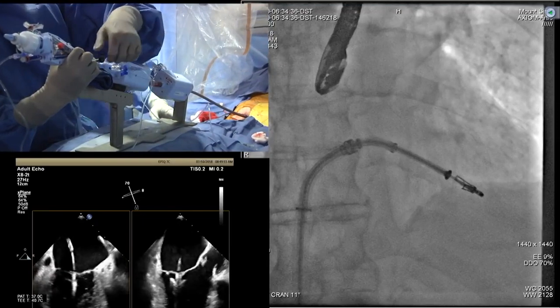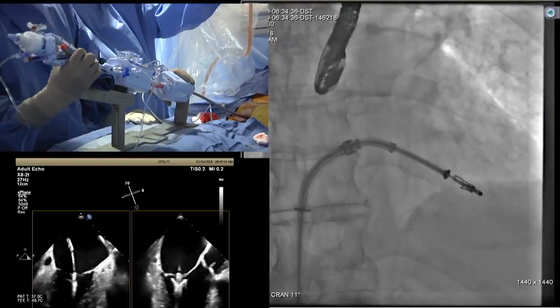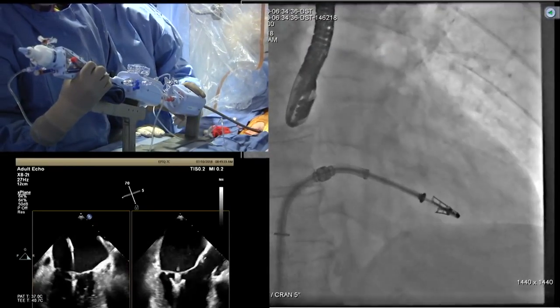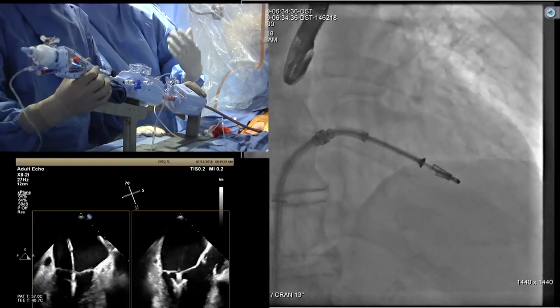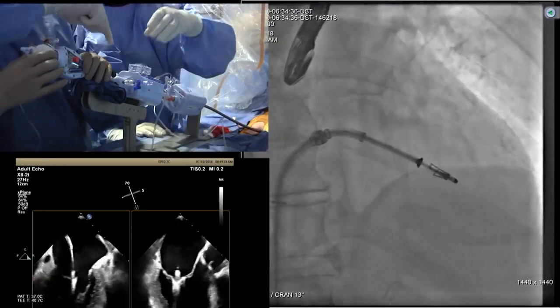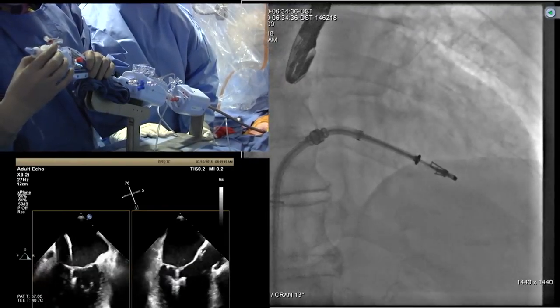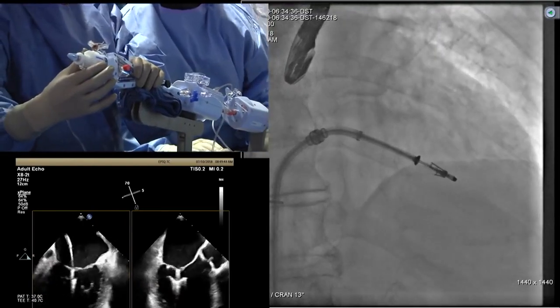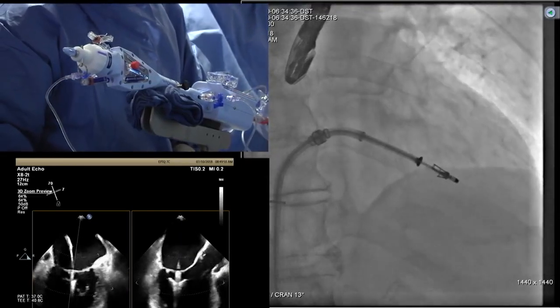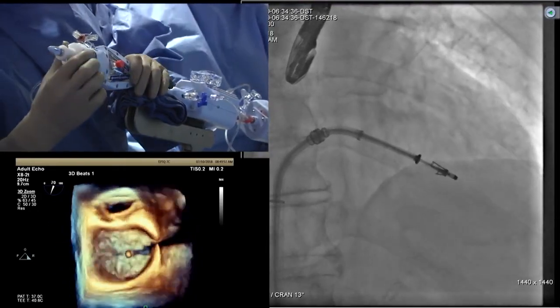And then same, I will tighten the knob, the black knob. You just take it a little bit more. We are at 60 degrees. You want to open it a little more? Now we have to open to 120 for grasping, right? So I'm going to open. It's locked. Opening it. Okay, open to 120. It's falling right on it already. This would be good. Is this a good joint for 120 or do you want more? Open a little bit more.